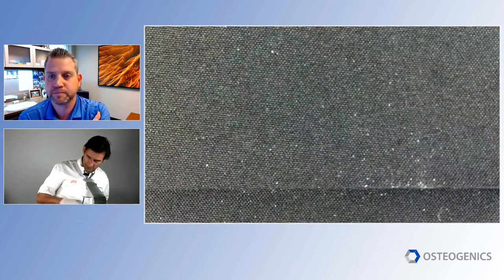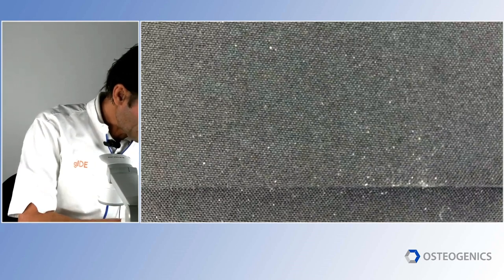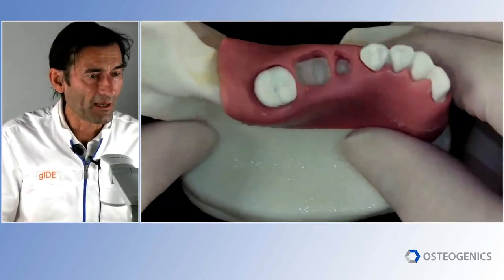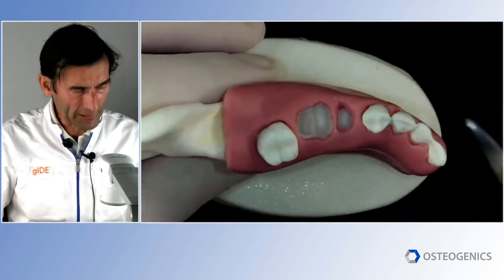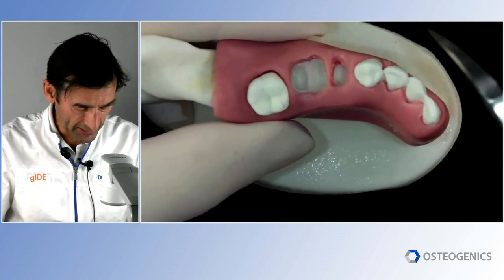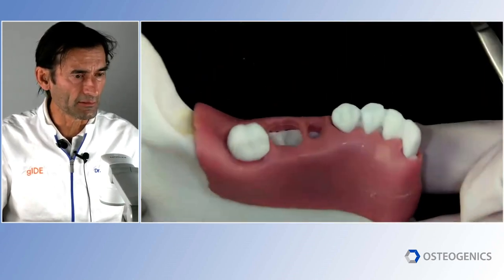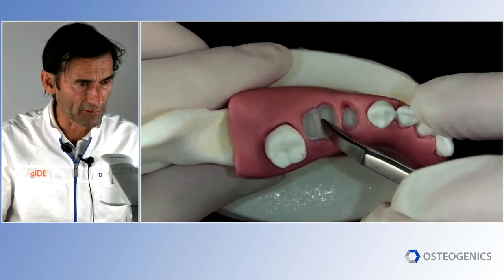Okay. Make a cut from here to here. Okay. Look, I actually did something already ahead of time, so I don't want to not do this while I'm here. I want to show you an extraction socket, because there are many times questions about what to do with an extraction socket when you're doing socket preservation. So I have here a model which I have from Straumann, and you can see here, this would be a potential implant placement or just a socket graft.